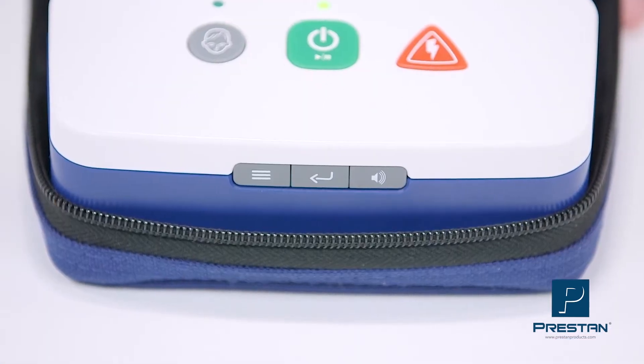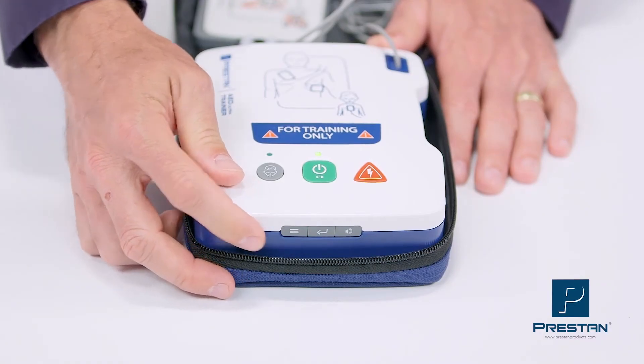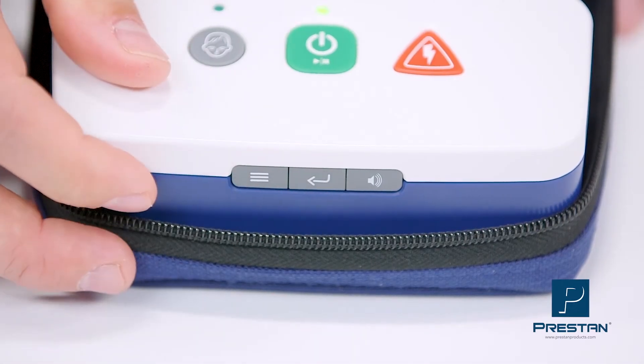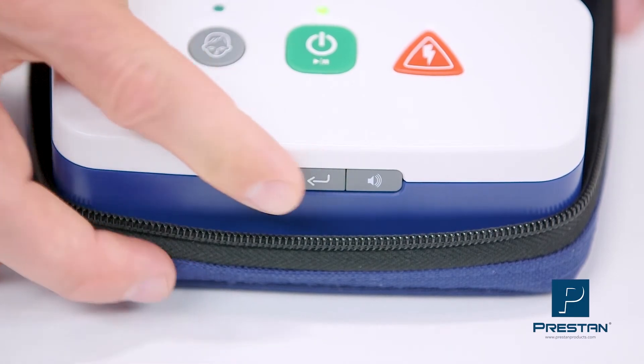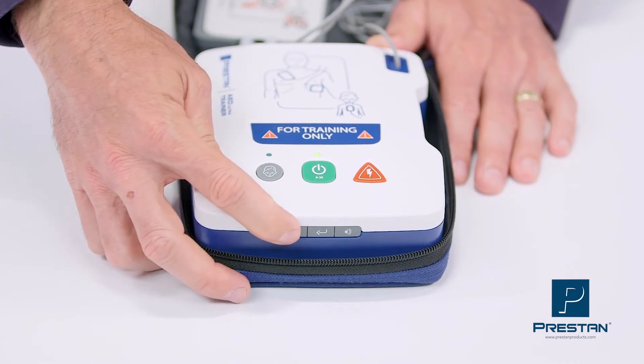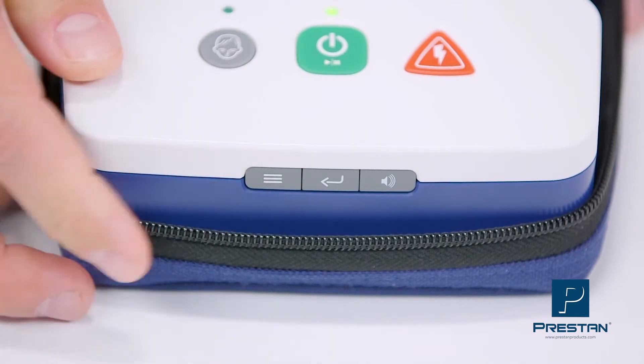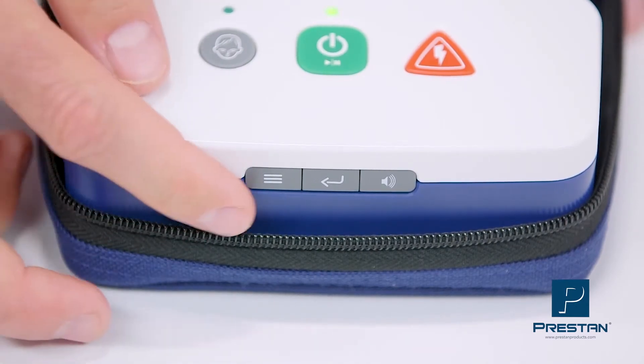The easy-to-use audio menu allows you to customize your training with options of automatic or semi-automatic shock, and five training scenarios.